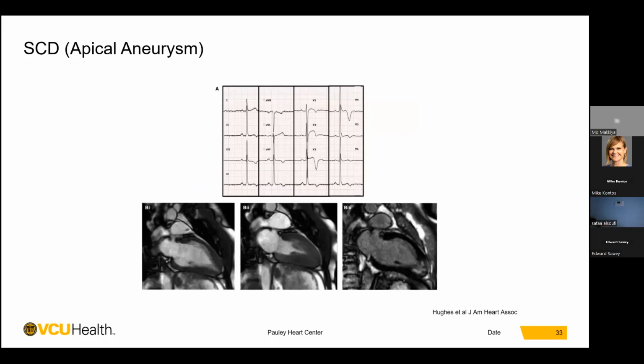Apical HCM is characterized by the lack of apical tapering and the presence of precordial T-wave inversion and cavitary obliteration of the apex. It can be classified into true apical or pure apical hypertrophic cardiomyopathy, or mixed, where there is a septal and apical HCM, with the apical being predominant, and finally relative apical HCM, where it is not pure apical hypertrophy, and the apex is thickened but does not cross the 1.5 centimeter thickness.